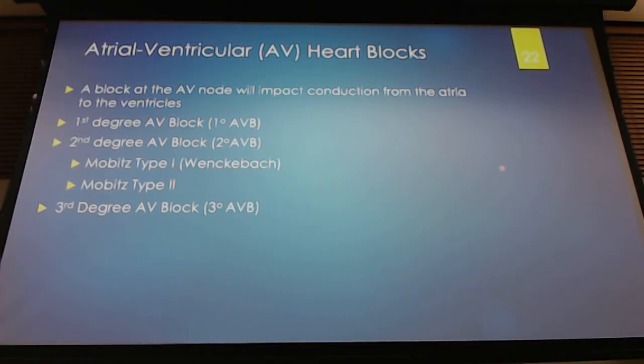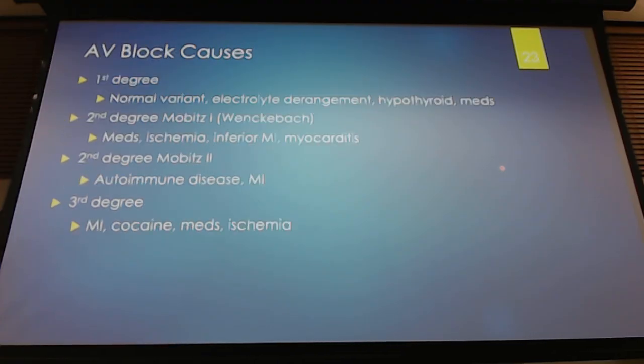All right, next thing we've got to talk about is our AV blocks. We've got first degree AV block. We've got two types of second degree AV block that we'll talk about. And then we have third degree block. Okay, first degree block.